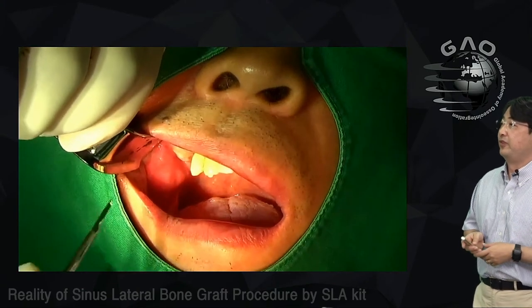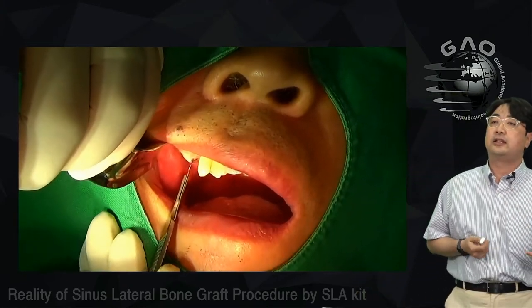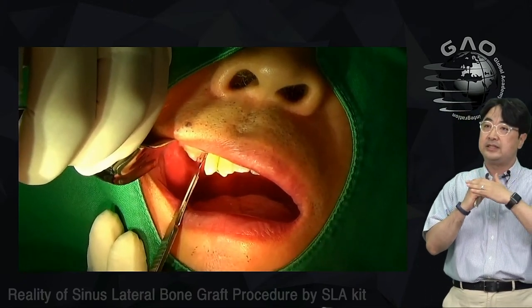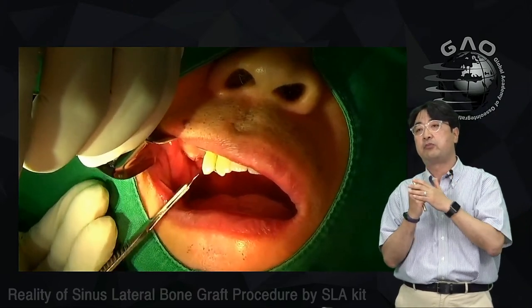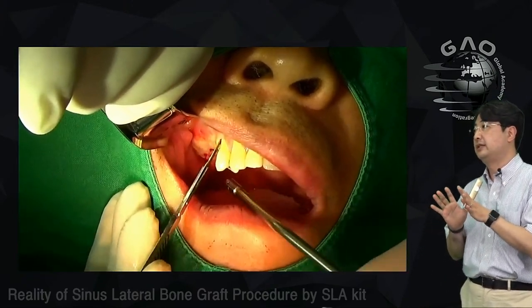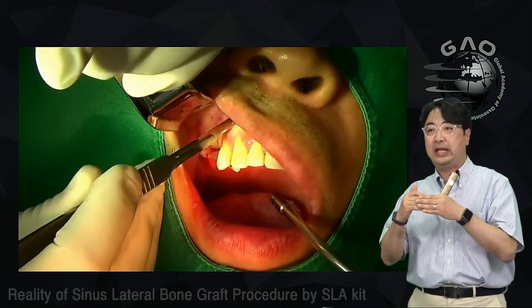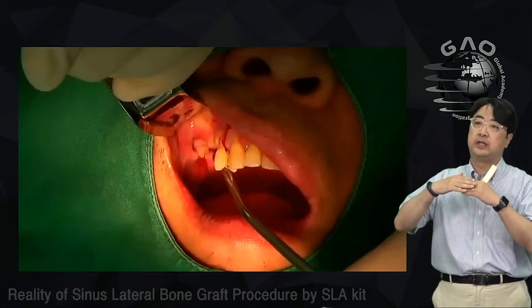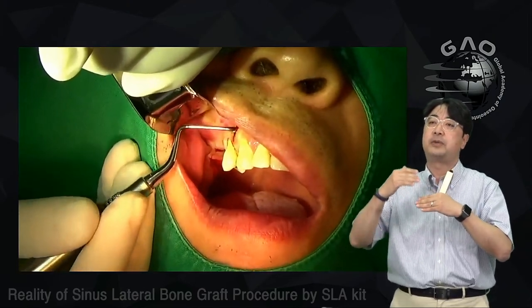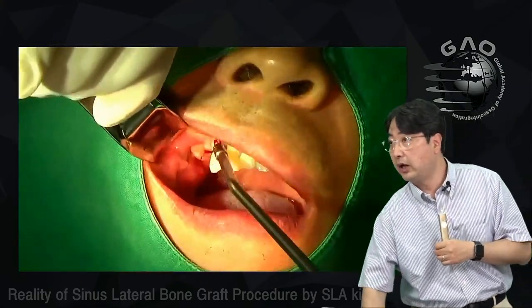So let's see another movie. My colleague didn't put anything between the maxillary sinus opening and the maxillary sinus membrane. So it means the periosteum and the sinus membrane are sticking together, and you have to dissect it, right? If you try to separate the sinus membrane and the periosteum, you're going to have a big problem: some opening or tearing of the sinus membrane. So you have to go above. You dissect the muscle, not the periosteum. I'm going to show you how it works.